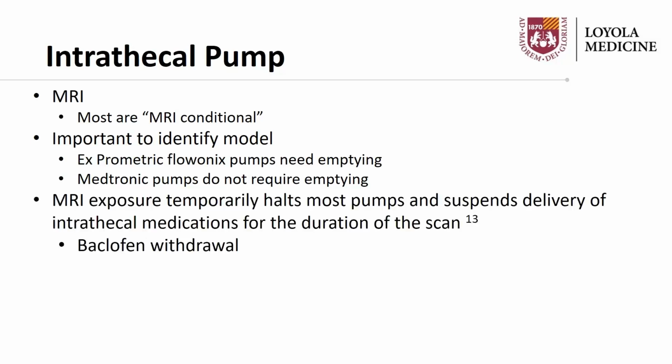It is also very important to note that MRI exposure temporarily halts the pump and suspends delivery of medications for the duration of the scan. Therefore, prior to any scan, it's important to determine if drug delivery can be safely suspended or if a drug needs to be supplied via an alternate route, such as an IV route. The device should be interrogated after completion of MRI and restarted appropriately.